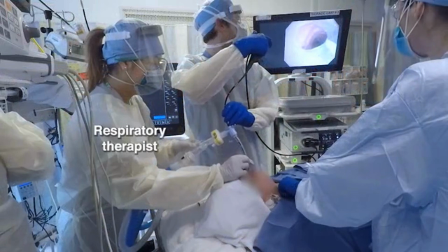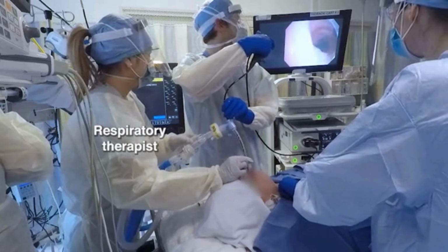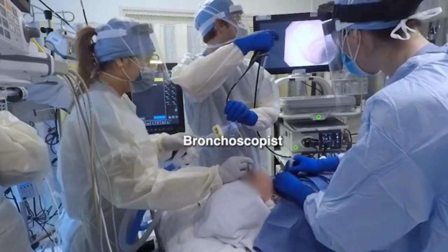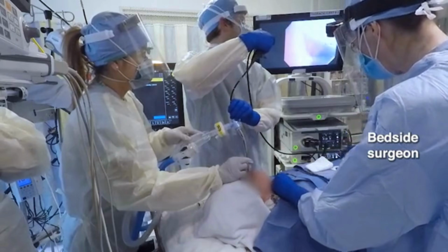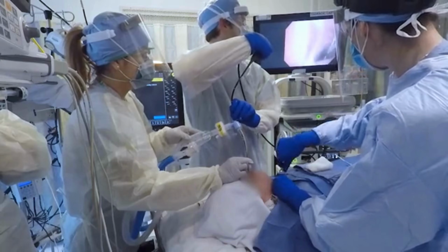The respiratory therapist should be at the head, controlling the airway and ventilator. Position the bronchoscopist at the patient's left, near the bronchoscopy cart and monitor. The surgeon should be on the patient's right, viewing the bronchoscopy monitor. Left-handed surgeons may prefer the opposite.